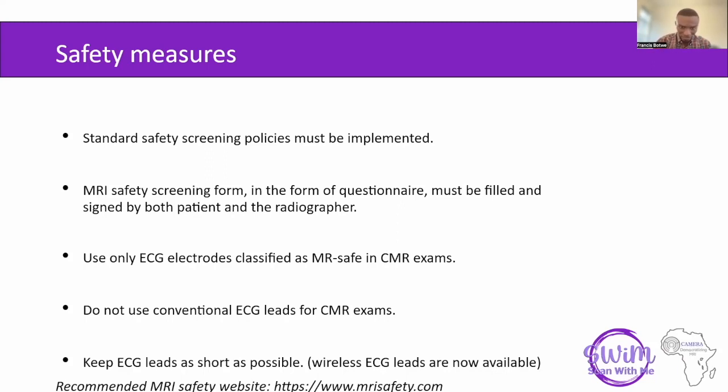Most of the vendors give out a lot of manuals, so you are very sure that this particular electrode can be used in your MRI environment. And if you are not sure, you just have to refer to the manuals to be ascertained. If not, you're going to cause a lot of problems.